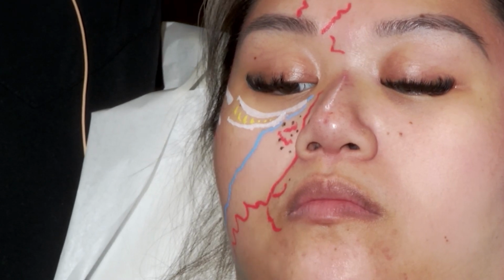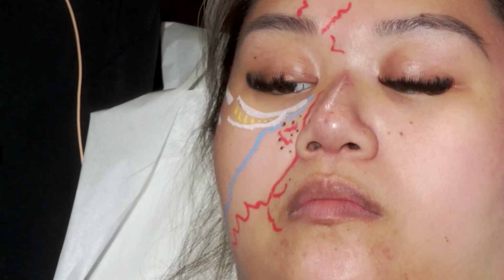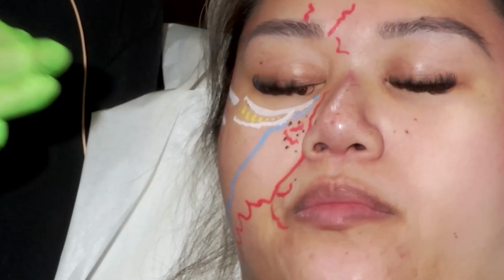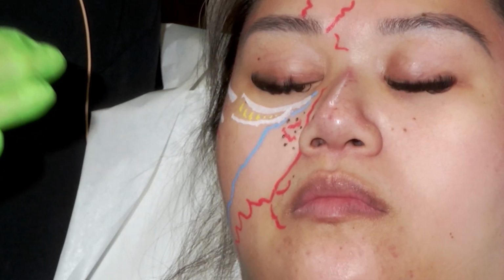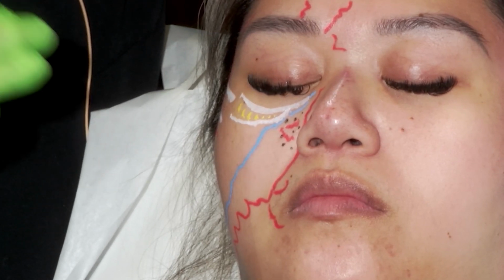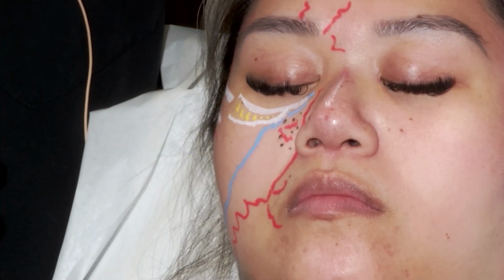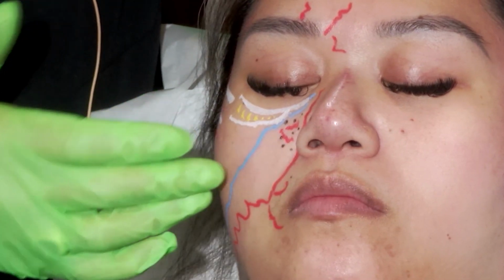You want to use a 25-gauge cannula or a larger size. You want to constantly move that cannula. If you're stationary, don't push the plunger. You want to be gently putting down small amounts of product, be patient, and basically, if you're unlucky enough to be in a vessel, you want to hope that you're in and out as quickly as possible with as little product as possible. And so there is no safe place on the face, period, none. Is this higher risk? Yeah, but do you want to try and give a complete result? Yeah.